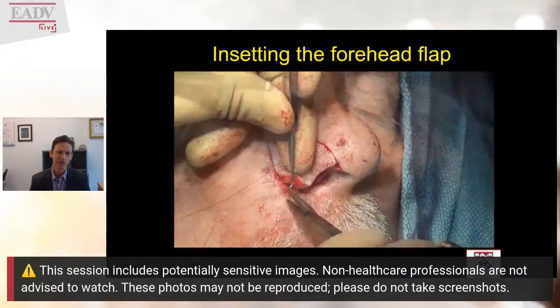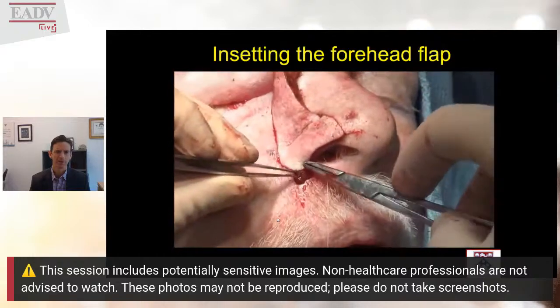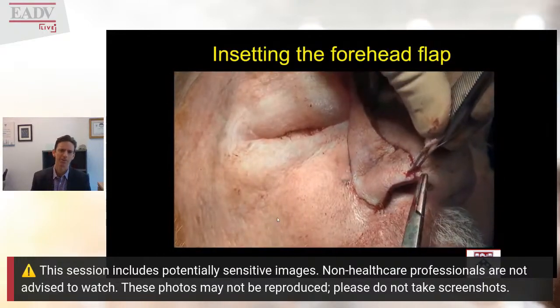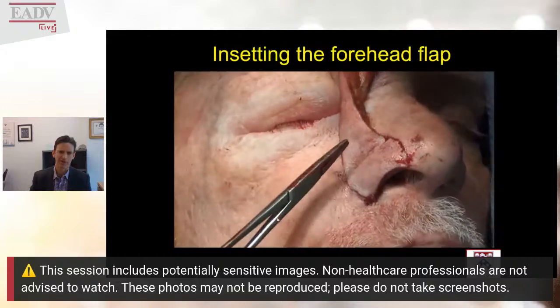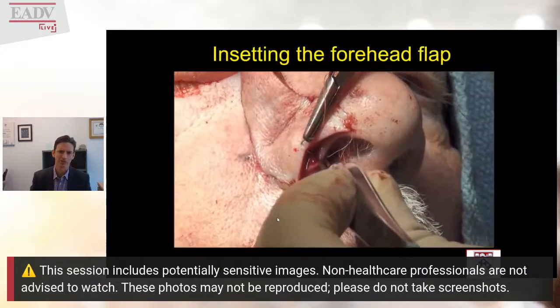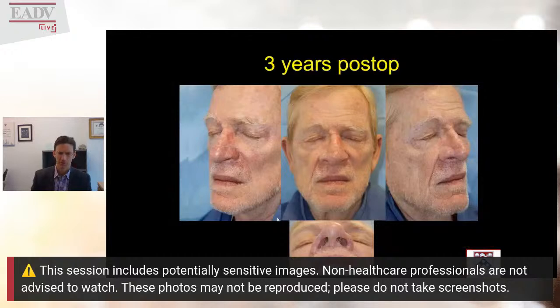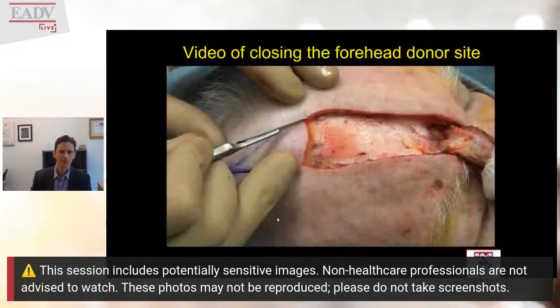At the margin of the nose, you won't be able to apply any deep sutures, so everything will be top sutures. I prefer a 5-0 chromic gut suture for these, or a 5-0 fast gut. Here's the patient 3 months after surgery.